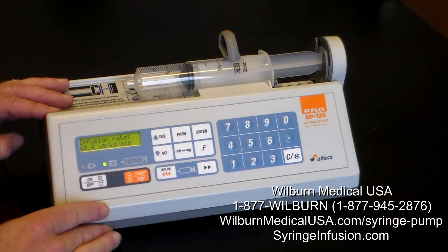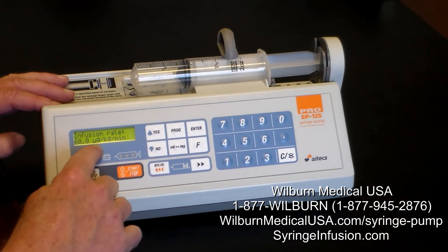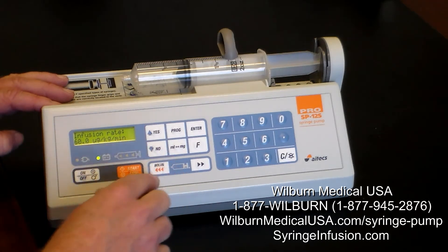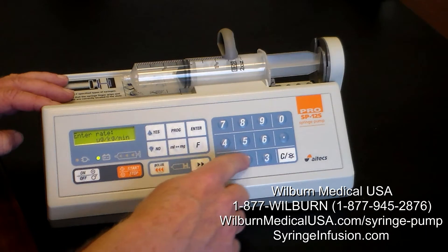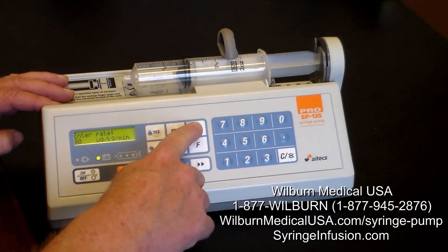The infusion rate is currently set at 60 micrograms per kilogram per minute, but if I want to change that rate, we simply press the program button. For example, we'll make it 80 micrograms per kilogram per minute and press enter.